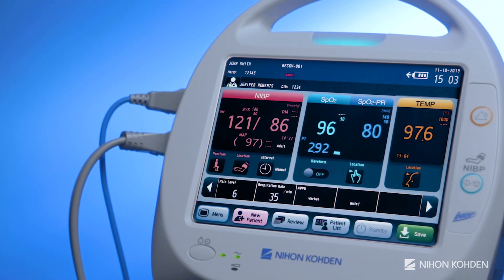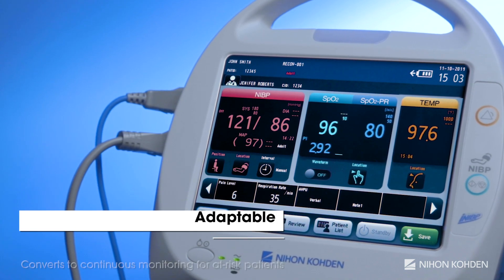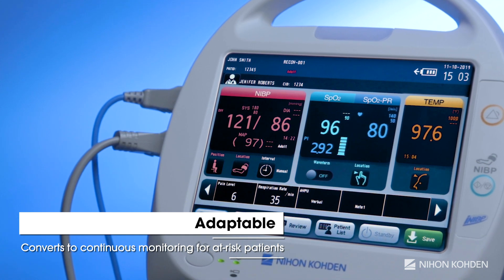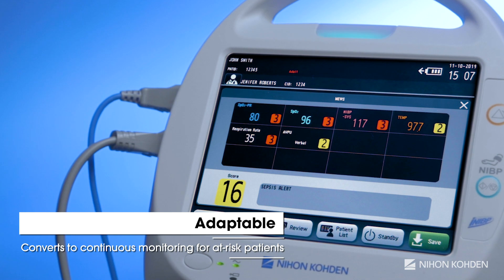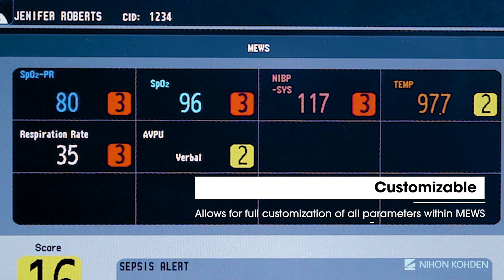The LifeScope SVM7200 can also be used for patients who require closer monitoring by easily converting to continuous vital signs monitoring mode and employing the built-in MEWS, or modified early warning score, which allows clinicians to set alarms for patients who may deteriorate between rounds or shifts.